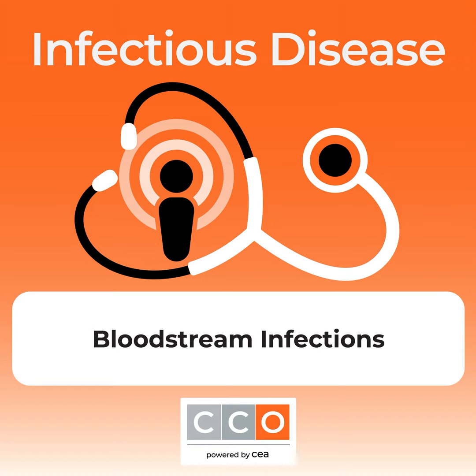This can be something that lends itself well to the implementation of an algorithm or a decision support tool to inform when initial and repeat blood cultures should be done at the time of blood culture ordering, based on pretest probability of bacteremia and host characteristics. And when this is done in conjunction with end user stakeholders and hospital leadership, you can see a real impact in culture utilization. So now that we've established how to optimally order blood cultures, let's transition to the workup of these cultures in the lab.